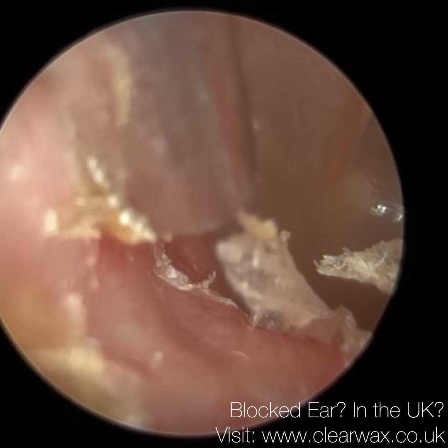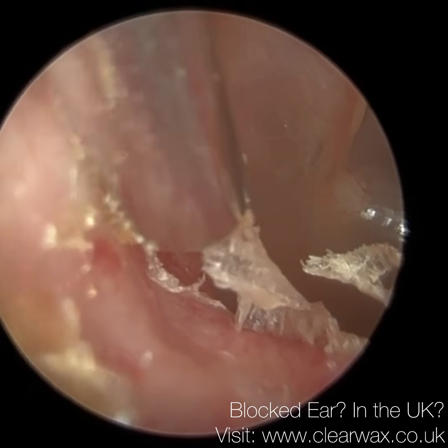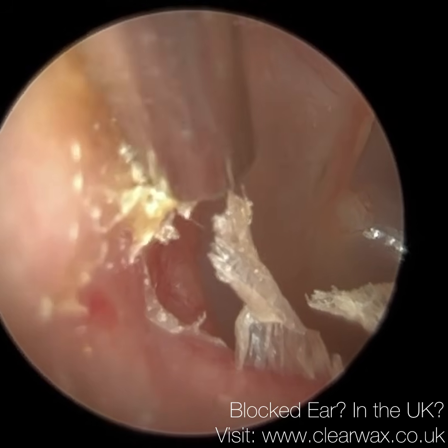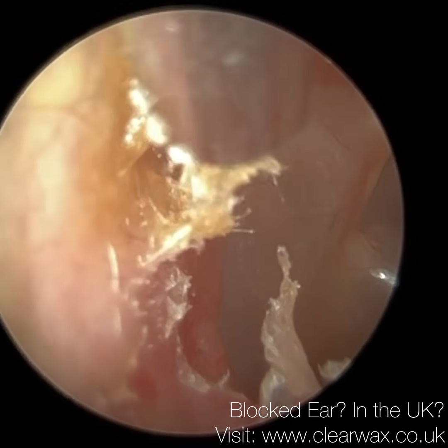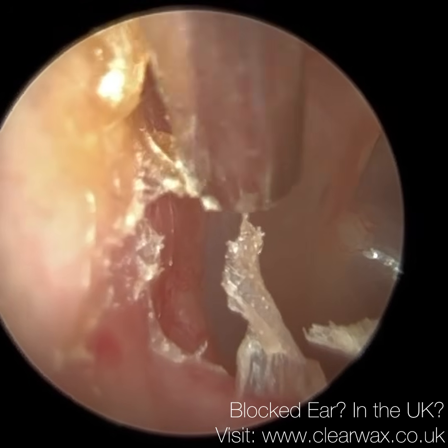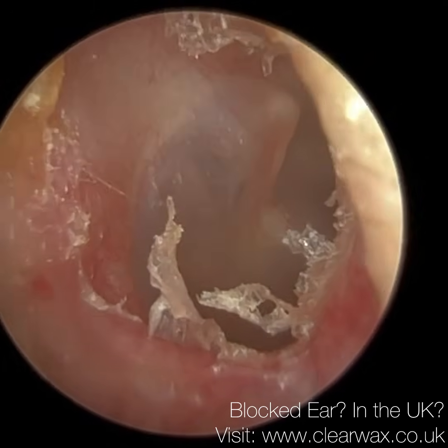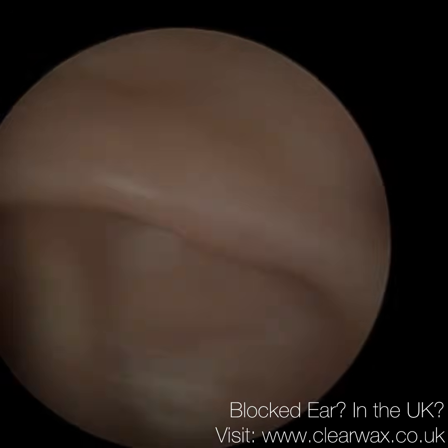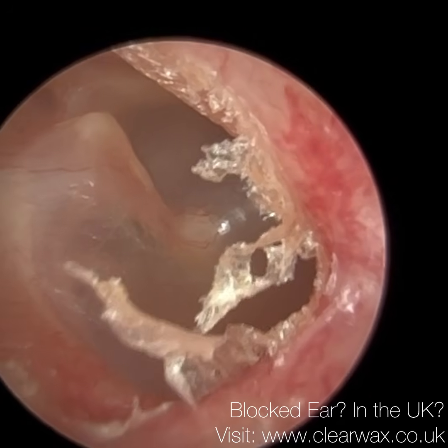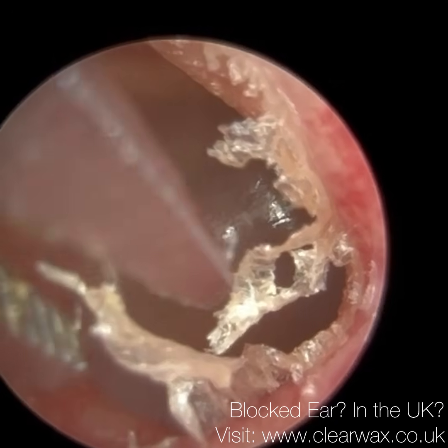When you've got such a widening like this, the skin gets trapped within the erosion, the crater, and then it can't escape back out. So inevitably they're going to get a buildup of dead skin. And if that skin isn't regularly cleaned, that skin can then get infected, and can cause ulcerations of the floor of the ear canal and expose the underlying bone. But again, in this ear, there's no ulceration. The skin is fully lining the ear canal. So I think I'm just going to reach out for the forceps.